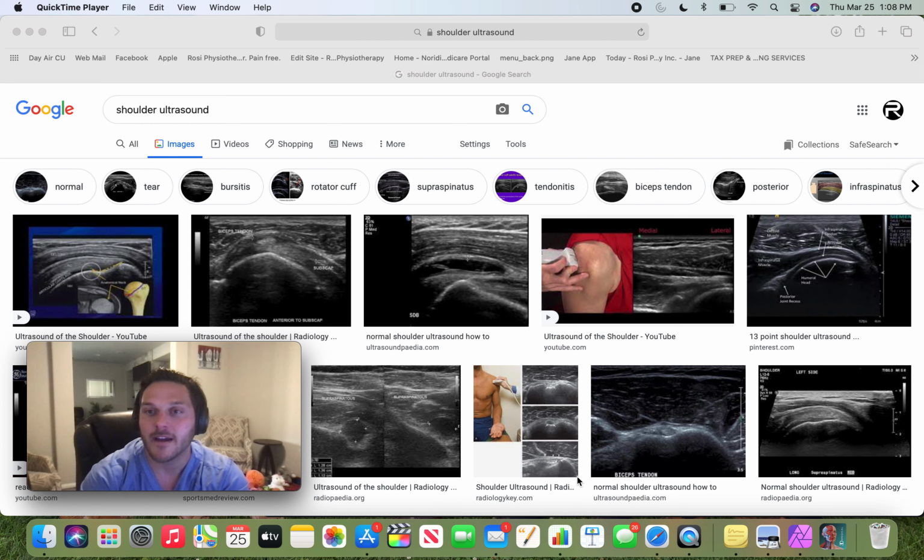Well, one of the things I found in the last couple of years to really stimulate or facilitate that assessment would be the diagnostic ultrasound. That diagnostic musculoskeletal ultrasound really helps us as physiotherapists, as movement specialists, as musculoskeletal practitioners, especially in the outpatient orthopedic world, in that we get to diagnose our patients and really facilitate that diagnosis in real time by stressing those tendons and stressing that soft tissue, really.